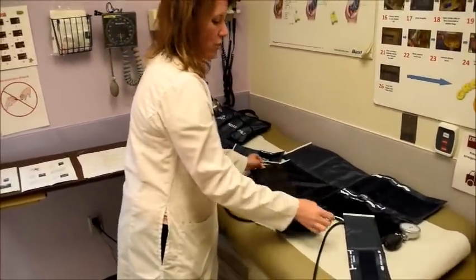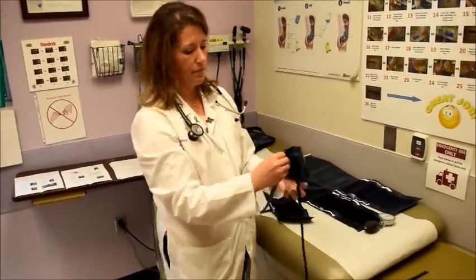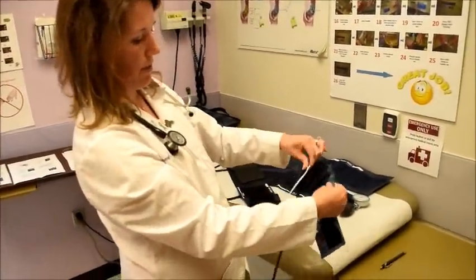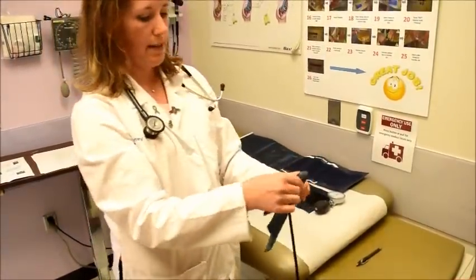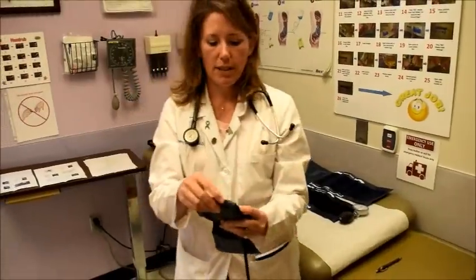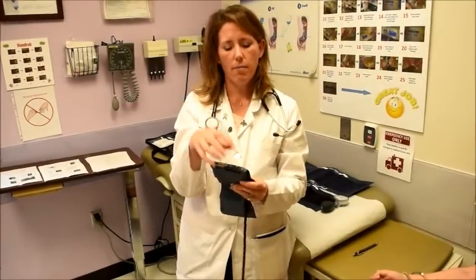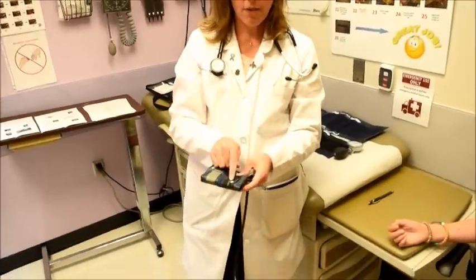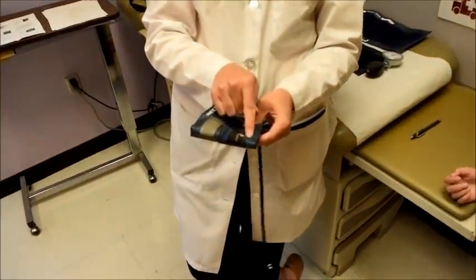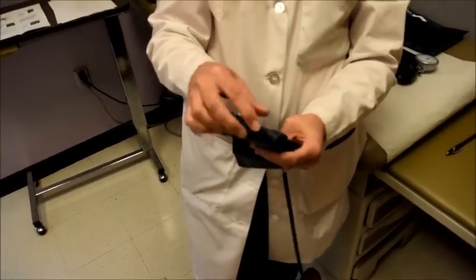And what you're going to want to do is identify where the midpoint of this bladder is. So you're going to find the ends, the two tips, and approximate them to determine where the midpoint is. And it's an important step to do this because this midpoint, again, you want to have centered above the brachial artery so that the brachial artery gets more symmetric compression. And you'll note that on the cuff, there's a marking where the artery should be, but you should disregard that and really focus on where the actual middle part of that bladder is.